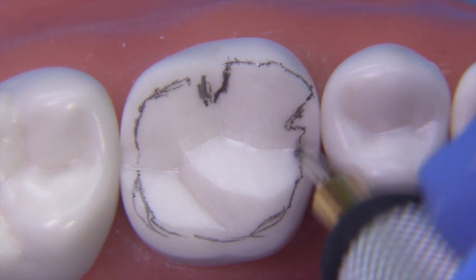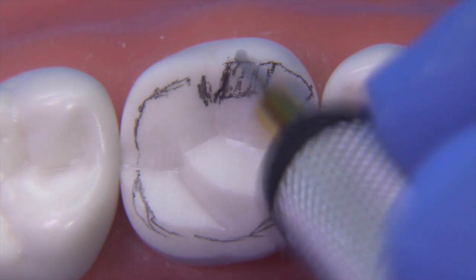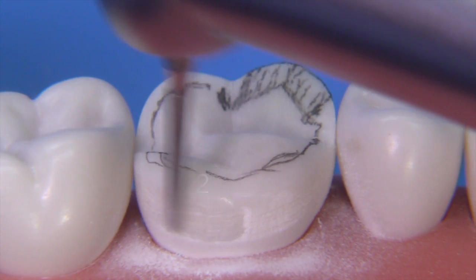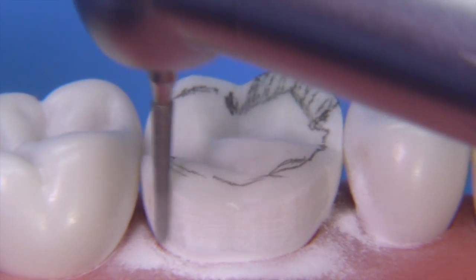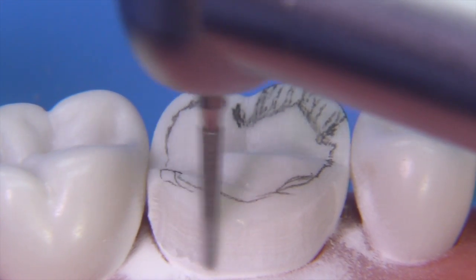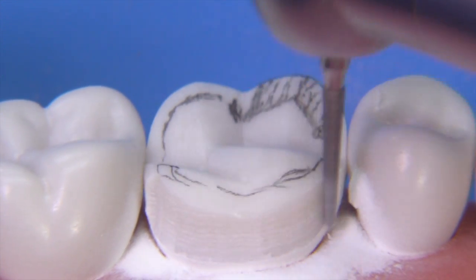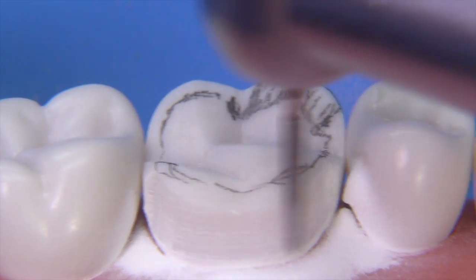The groove will be located somewhere in the mid-facial area, but the finish line will be mesial to that. On a typodont, it's not a bad idea to draw on it just to get to know where you're headed. We're going to use the axial reduction burr, the 878K 012, which gives a very conservative chamfer at first but provides optimal taper. The burr is fairly thin, allowing you to go interproximal using the divide-and-conquer technique — leaving a little bit of contact not broken, then subsequently using a much smaller burr to break through.